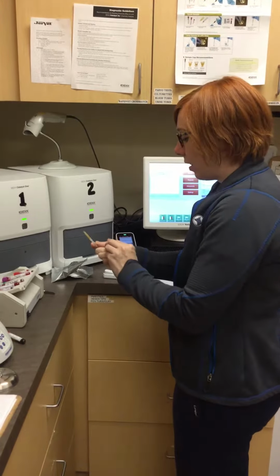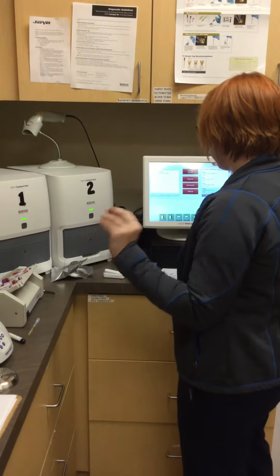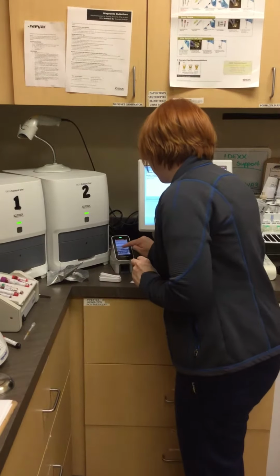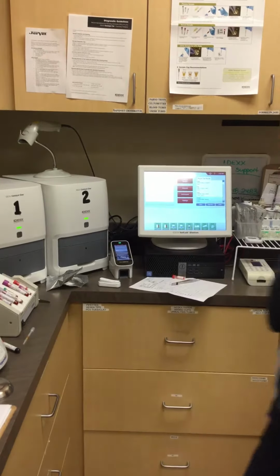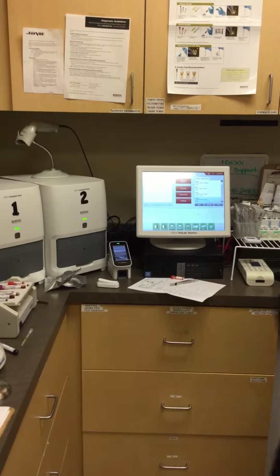I'm going to invert it 10 times. I'm going to put the patient's name here, which is Tilly, and her last name is S-E-A-Y.